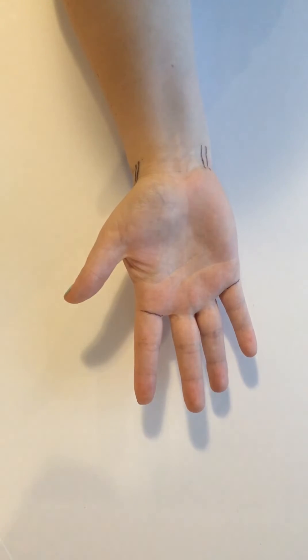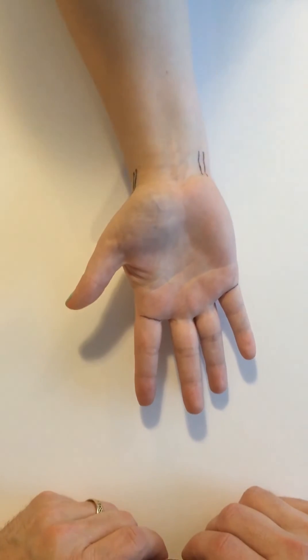There are a couple different ways that have been described to do a figure-eight method of measuring hand volume, but this is the method that the American Society of Hand Therapists has adopted.